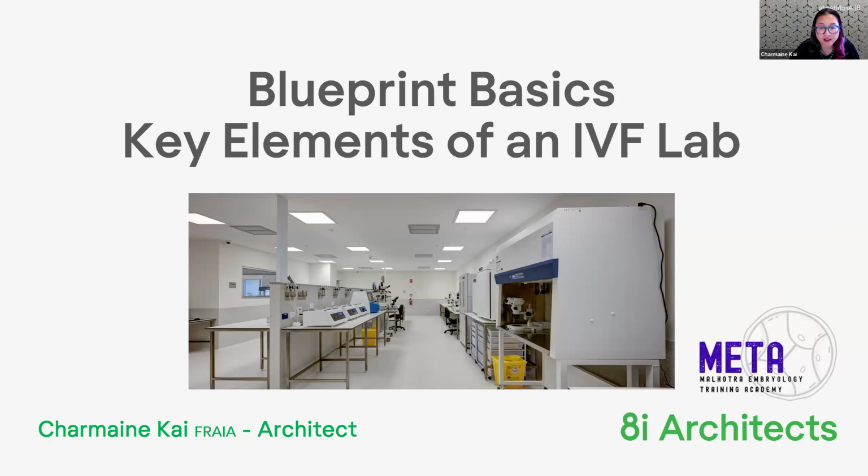And you can see in this, we've got good lighting through it. We have a lot of connections with adjoining labs next door. We've also got really good quality air conditioning, and particularly the registers that you see here, these are the ones that you want for an IVF lab, simply because they do not push too much air through. I'll go through those in a bit more detail in a minute.